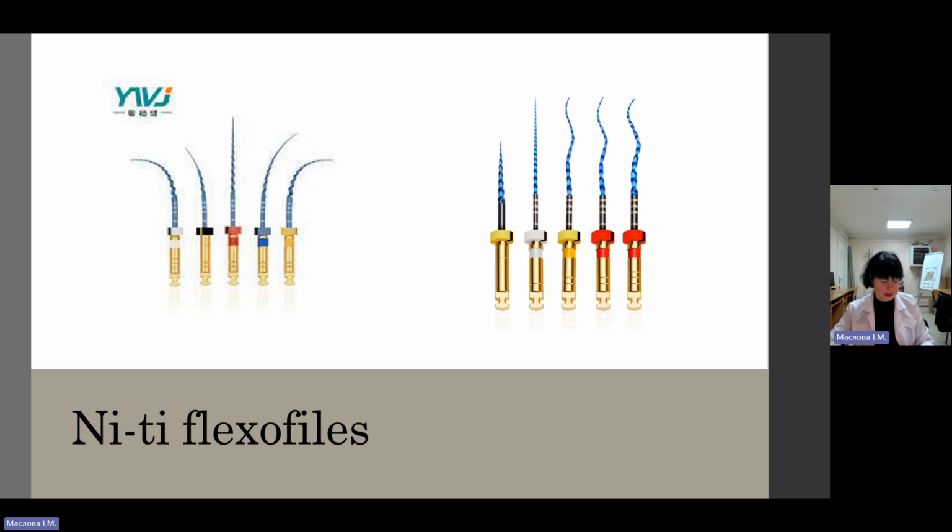Often it will be evident clinically and radiographically that the root canals are calcified in the orifice area. The microscope is then extremely useful. Sometimes a rigid explorer may be used to penetrate the calcified material. Other times, a long shank bur is used to remove hard tissue to explore the canal. Since the exact location of the root canal is not always known, the bur is used with careful shaving motions in the orifice area. The explorer is used at frequent intervals in an effort to break through the calcified tissue.